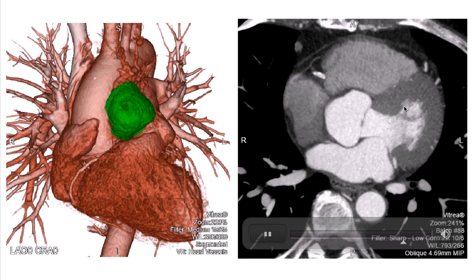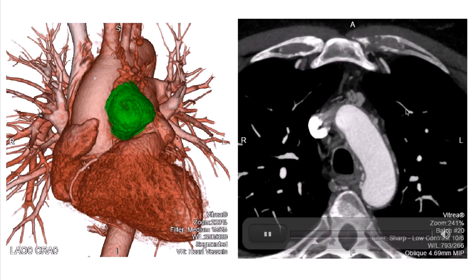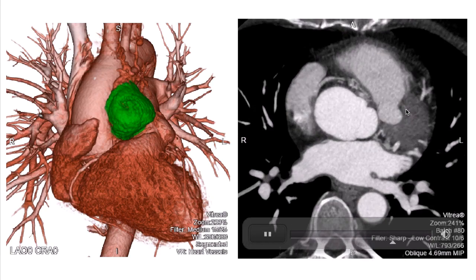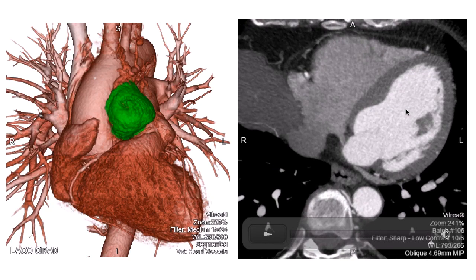So this is done in an early arterial phase, and we're already seeing very bright enhancement. Actually, it might even be brighter than the myocardium at this time point. So very avid enhancement. Right there, it's brighter than the myocardium. And this is super early arterial phase because it's a coronary CT. We still have contrast actually in the RV.